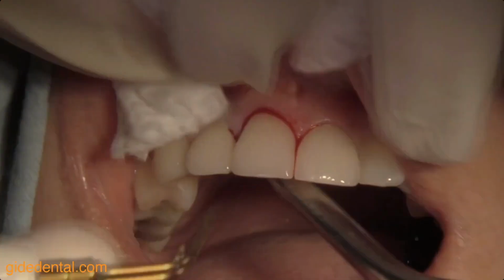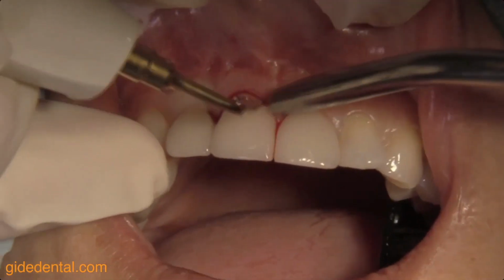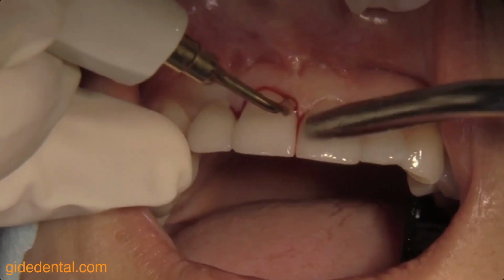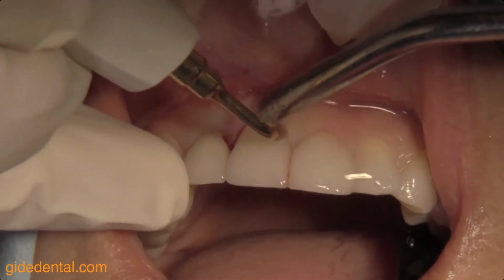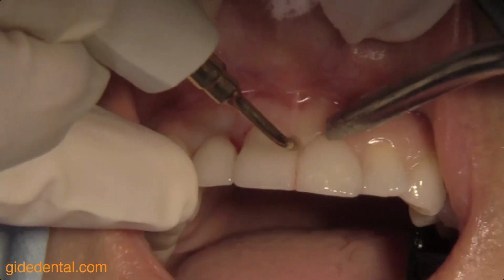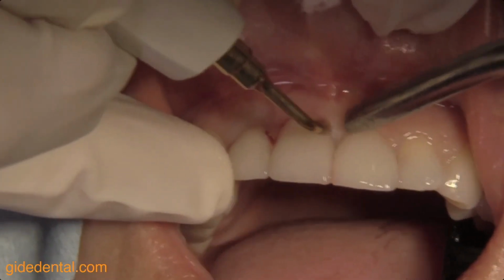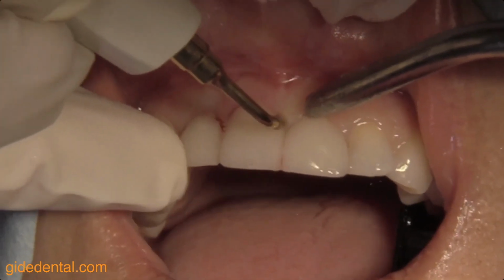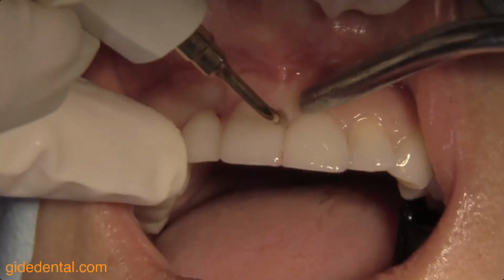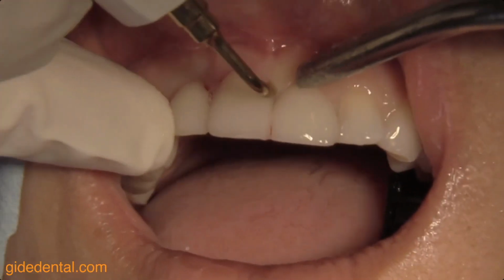Now we're moving with the second instrument. This is a piezo surgery instrument, and I'm using this as a periotome. So you can see how the periotome is moved through that space that I have already opened up with the scalpel. And now the idea of this periotome in the piezosurgery is to move gently into the periodontal ligament space and widen it without jeopardizing the buccal bone plate.